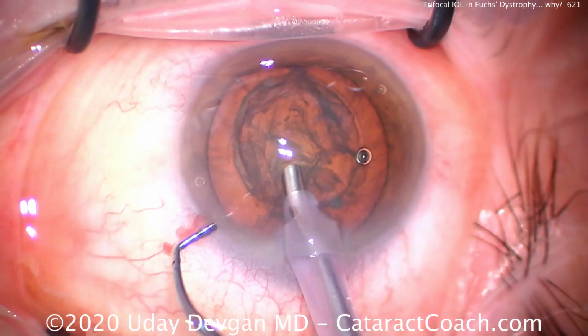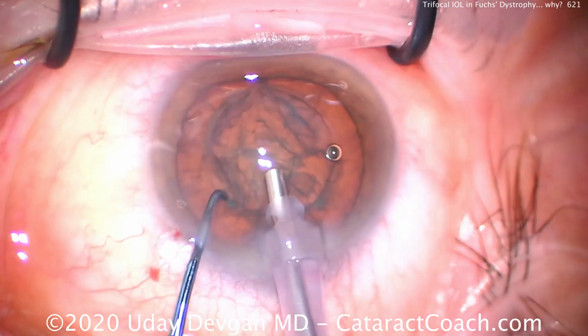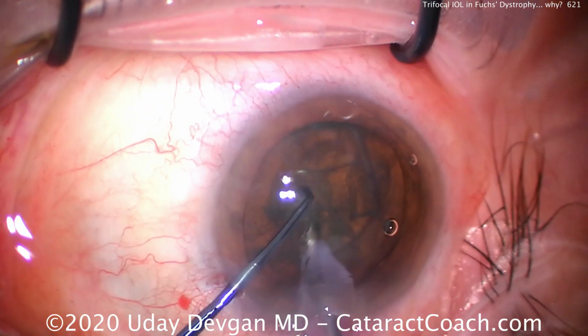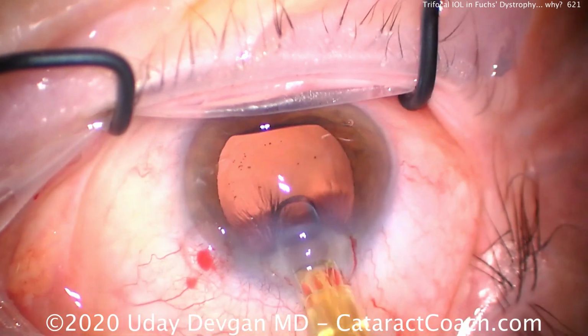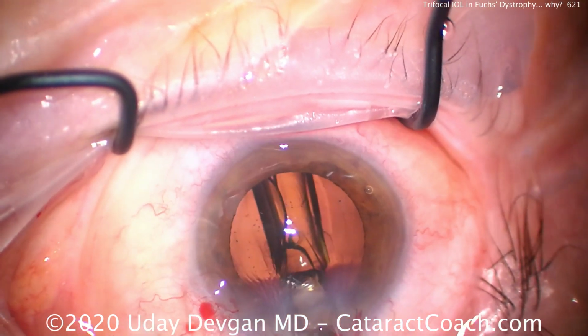So we'll do phaco chop in the bag, and we're going to operate low, away from the corneal endothelium. Here comes the phaco probe, here's the chopper. The rest you know, we're not going to talk about phaco chop here. The nucleus was removed with a bare minimum amount of phaco energy. At the end of the case here comes the IOL. Again, it's a trifocal diffractive design.